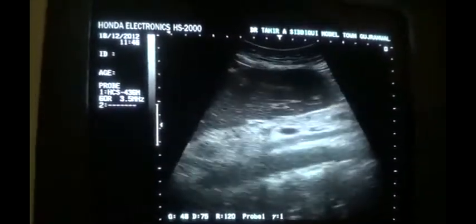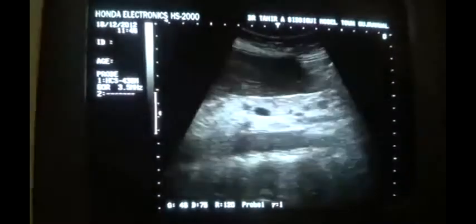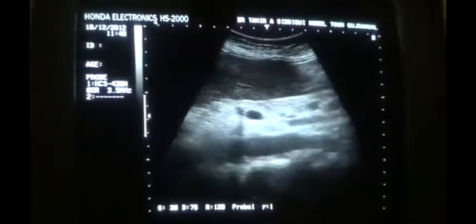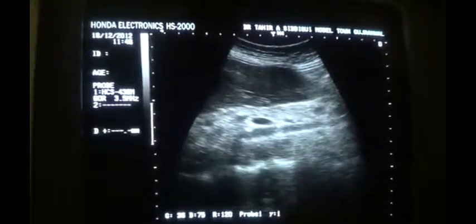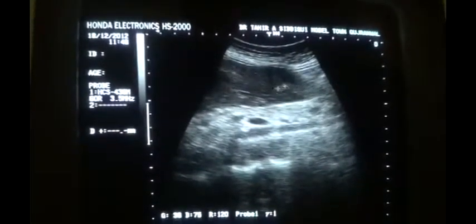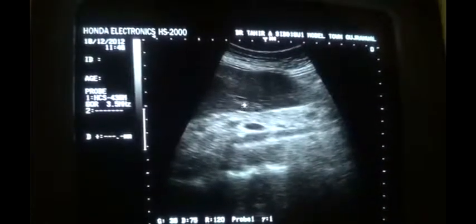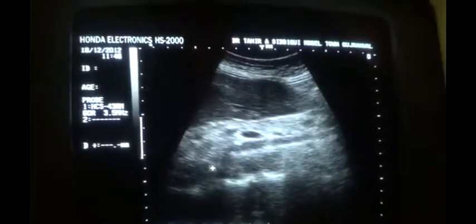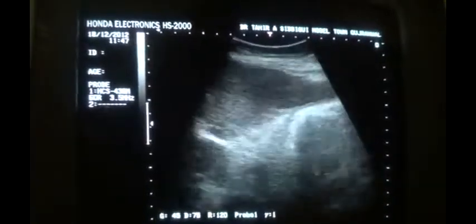Here you can see that the liver exceeds the origin of the superior mesenteric artery from the aorta. This is the superior mesenteric artery arising from the aorta, and you see that the liver is exceeding the origin of the superior mesenteric artery from the aorta.